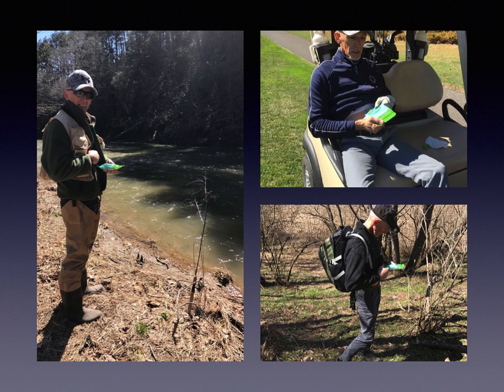So these are just some images of me and my lifestyle, where if I choose to go fishing and I need nutrition, I can just take one from my fishing vest that I've prepackaged, connect directly to my port, squeeze the contents, and then back to fishing. Same thing on the golf course. Put a couple in my golf bag, have a few throughout the round, and I can deliver one full pouch like that in probably 30 seconds. And the last picture is of me hiking, and the same process.